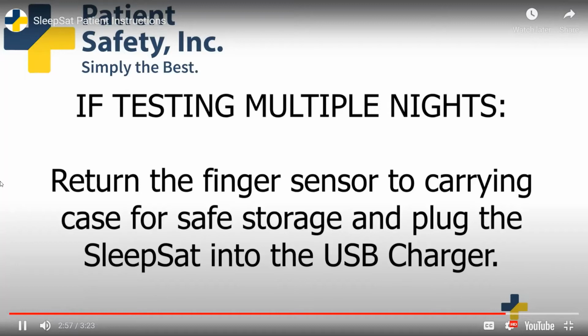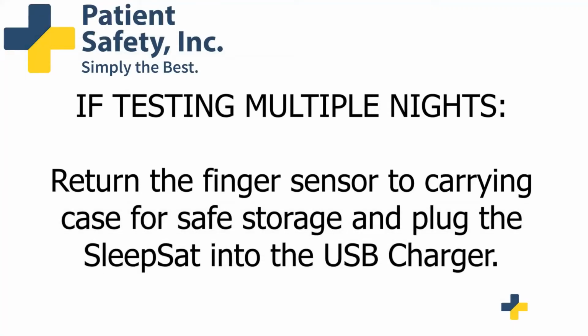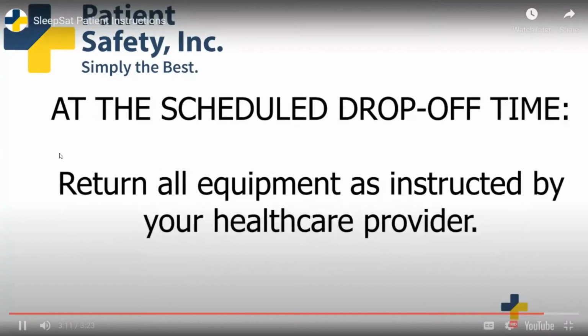If testing multiple nights, return the finger sensor to the carrying case for safe storage and plug the SleepSat into the USB charger. Charge the SleepSat for 4 to 6 hours, then repeat the test the next night. At the scheduled drop-off time, return all equipment as instructed by your healthcare provider.